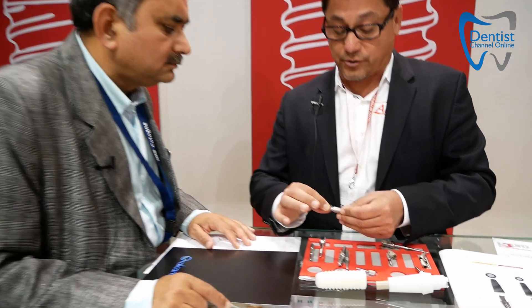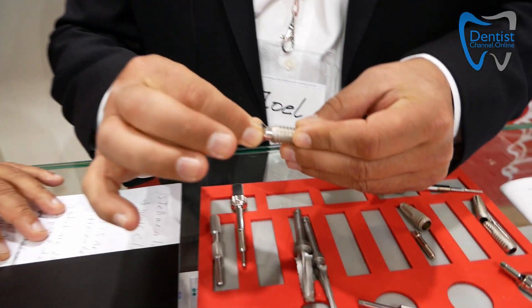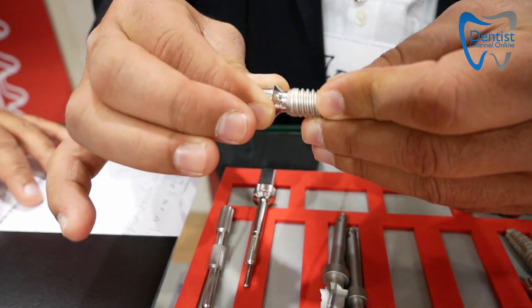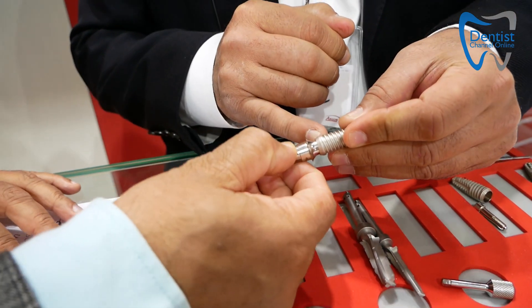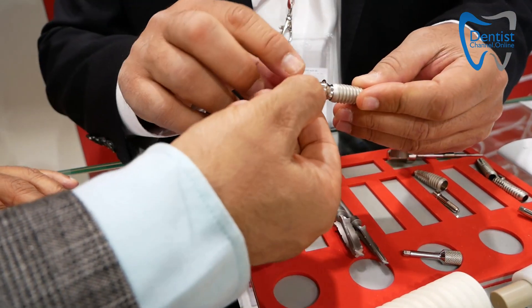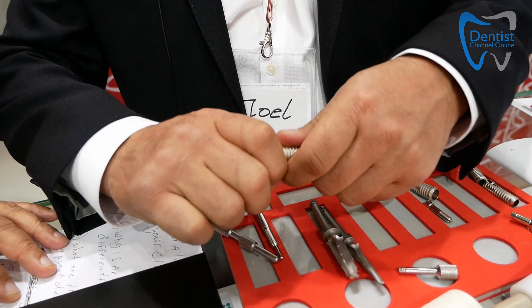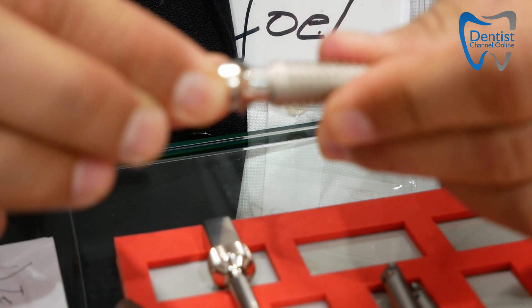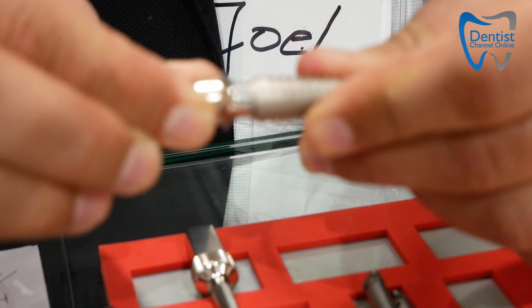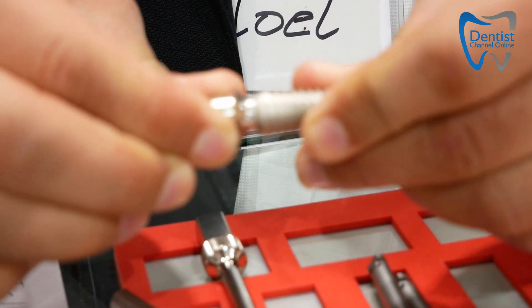So the internal hex is super deep — three millimeter well. You put this in and you slide it down, make sure the hex engages. And you literally see the action, it drops down into place. So now you see the gap is shorter here. Here it is when it's not mated, and then when you drop it into place, it mates and it drops down into place.